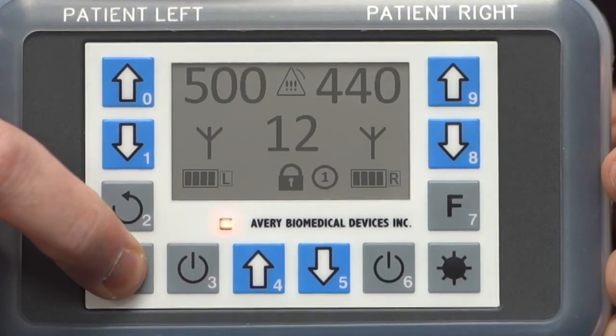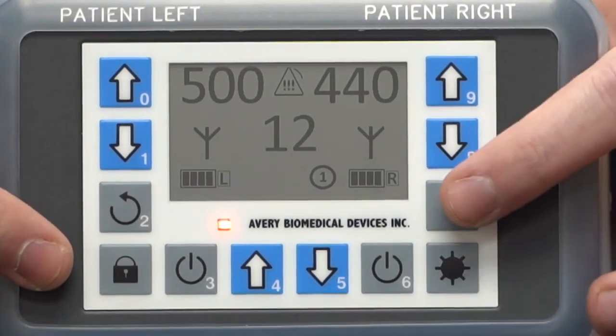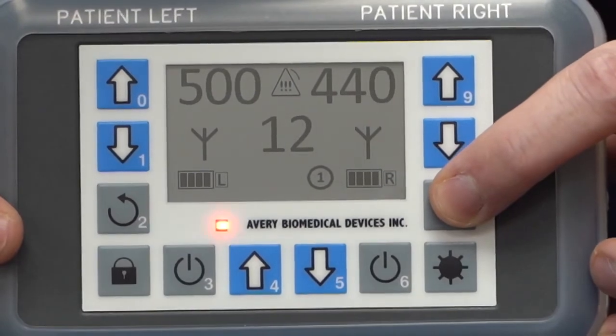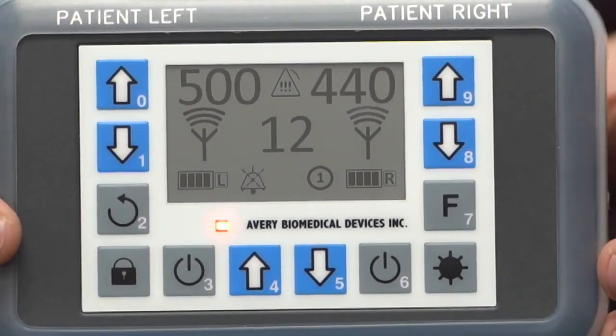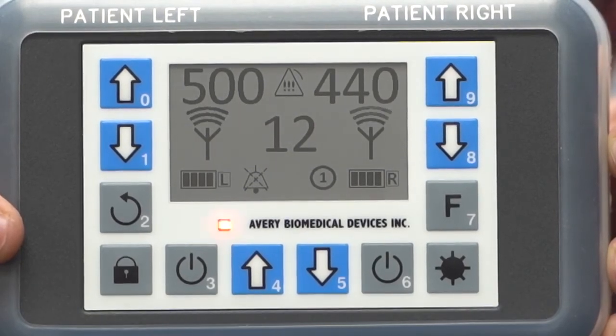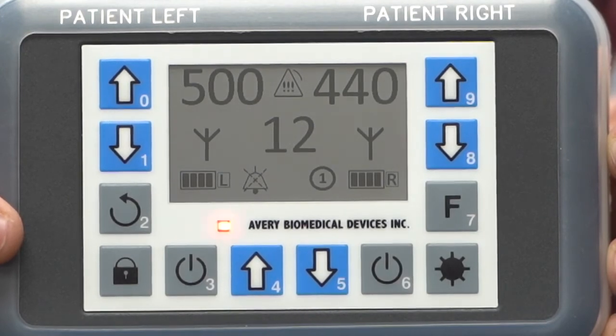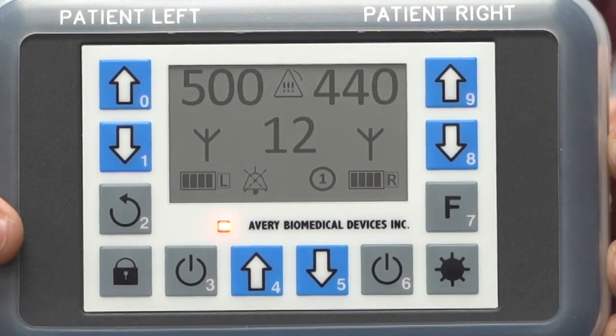All alarms can be temporarily muted for 30 seconds. Unlock the keypad and press the F key. The mute icon will appear, signifying that the alarm has been muted. After 30 seconds, it will disappear and the alarm will sound again. It may take a few seconds until an alarm is acknowledged or cleared.